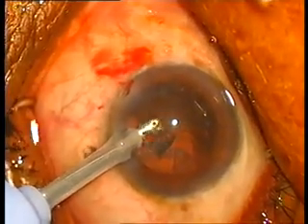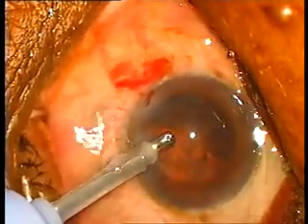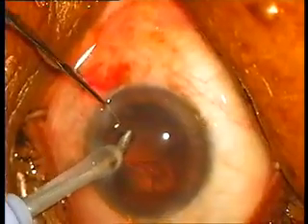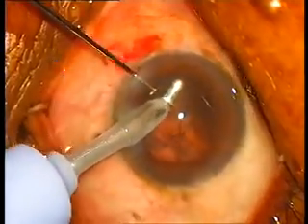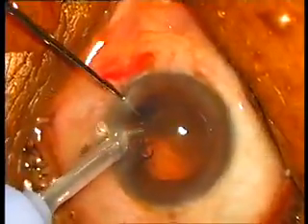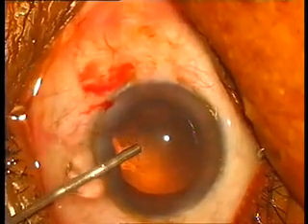Now I'm using the irrigation aspiration port to remove the remnants of cortex. A little bit of cortex is remaining in the 12 o'clock position. I'm trying to remove that. So I use high vacuum, 300 millimeter of mercury, Phaco, and very little Phaco energy is used. Yes, now the irrigation aspiration is complete.